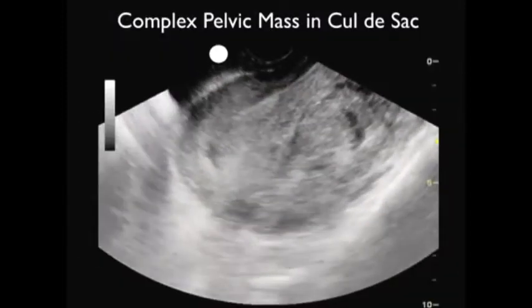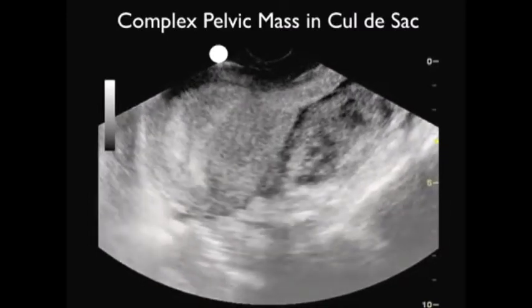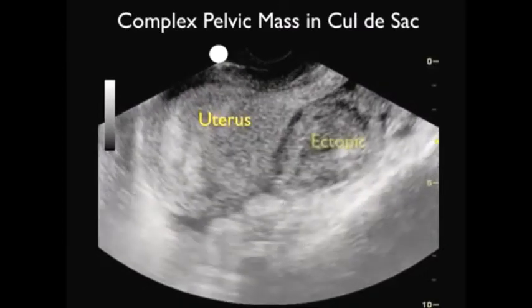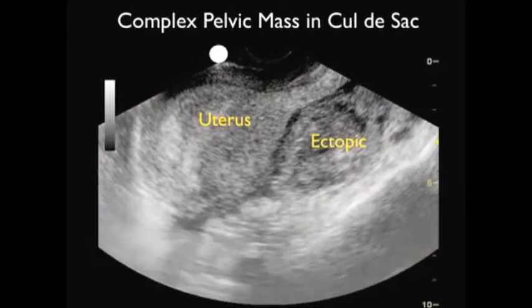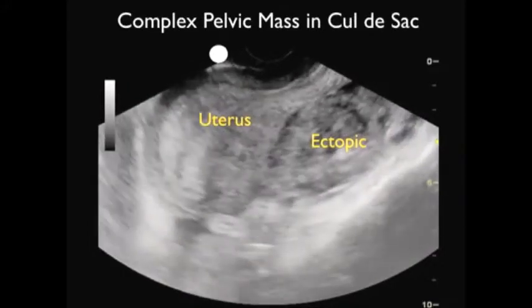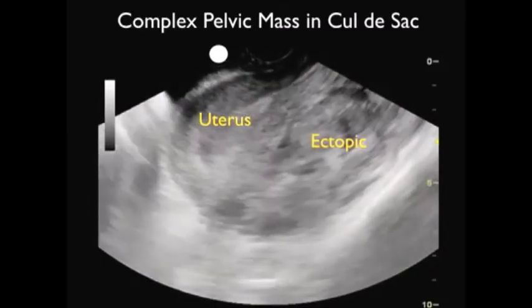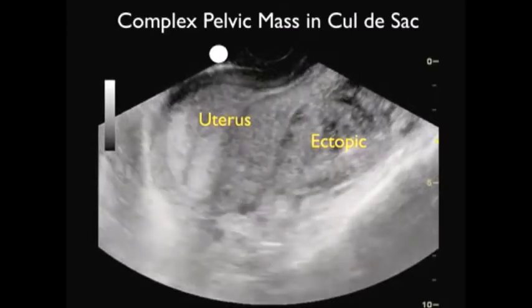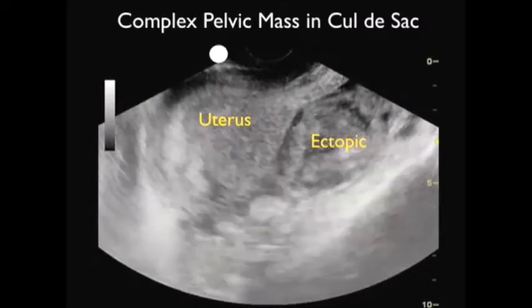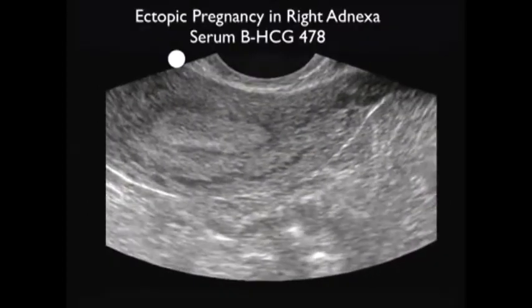Here's video from another patient who is pregnant and bleeding, and we note here the long axis scan through the uterus. Now at first glance it was difficult to discern where the margins of the uterus were and what was going on in the cul-de-sac, but as I closely inspected this view, I could see that the uterus was located anteriorly, and you can see the endometrial stripe, and that it was definitely a secondary structure, a complex pelvic mass that was located within the pelvic cul-de-sac. Very suspicious for ectopic pregnancy, and with OBGYN consultation this actually turned out to be a positive ectopic.